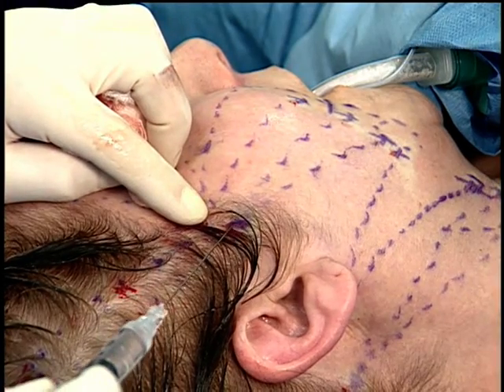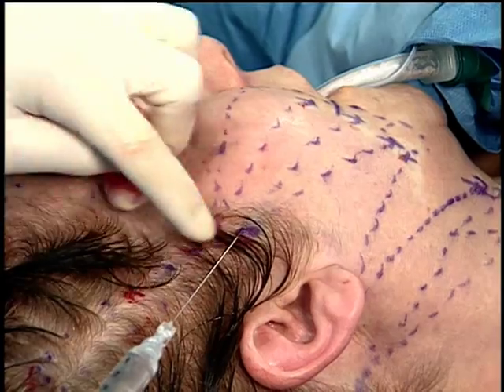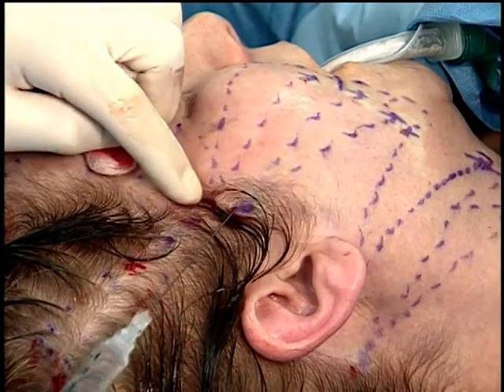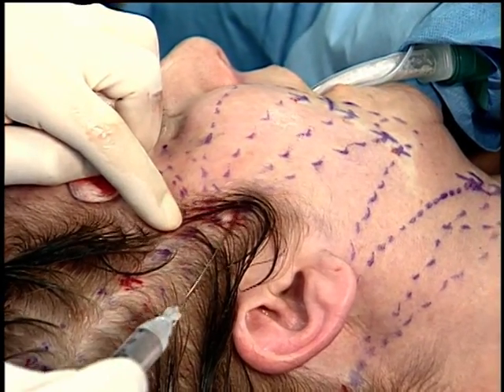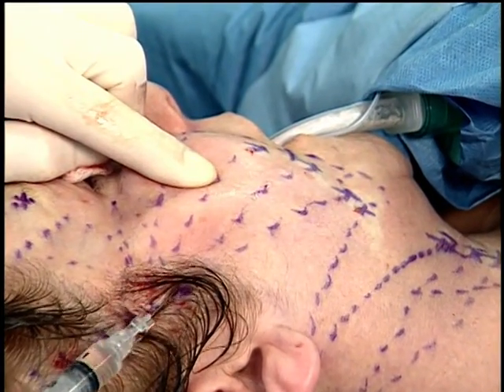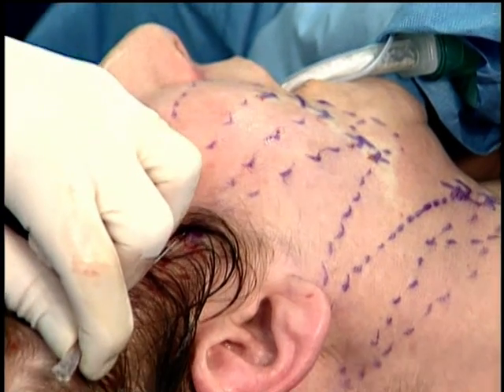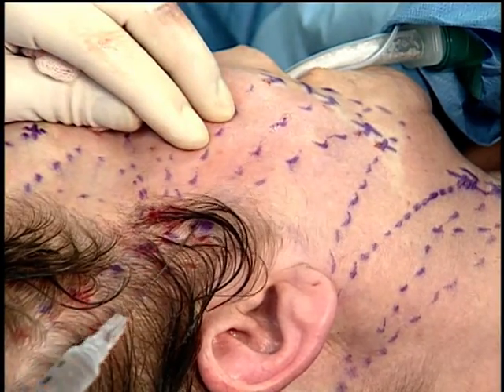Go down to your common anchor and deployment port for both the scalp loop lift, the U-shaped loop lift, and the N loop lift going out onto the face. Hydrodissect down this trajectory for this articulus thread, this limb of the articulus contour thread, down to your exit point, and then pull back and inject your 2.5 cc's. If you didn't have quite enough anesthesia, do that again and inject on the way back.